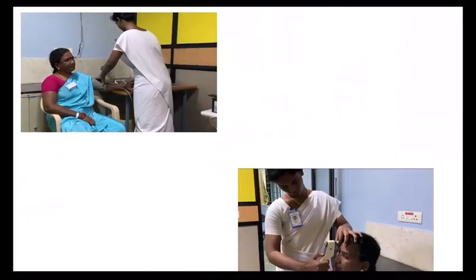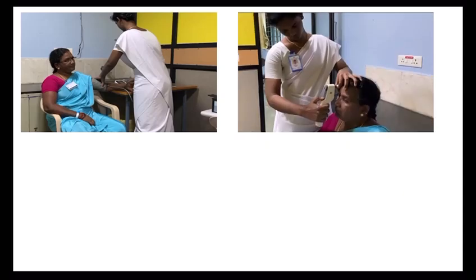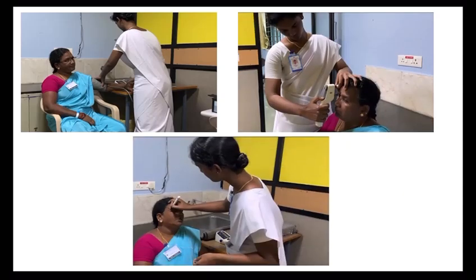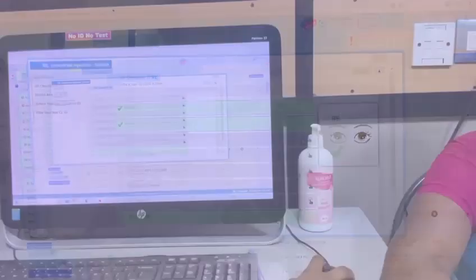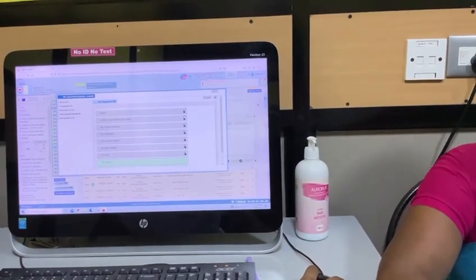Patient's blood pressure, intraocular pressure, and the eye to be injected is marked. Pre-injection checklist comprising patient's identity, use of antibiotics, and presence of congestion is marked.